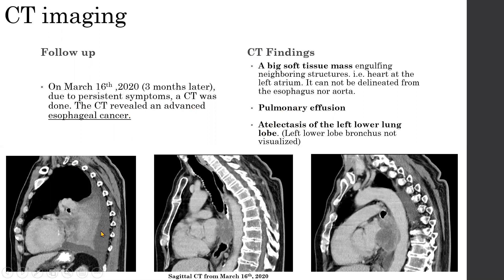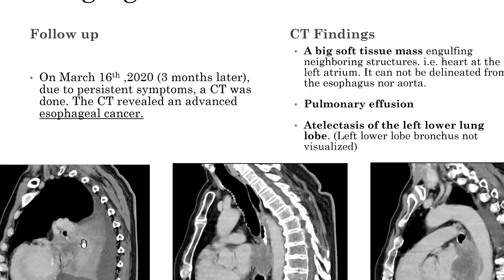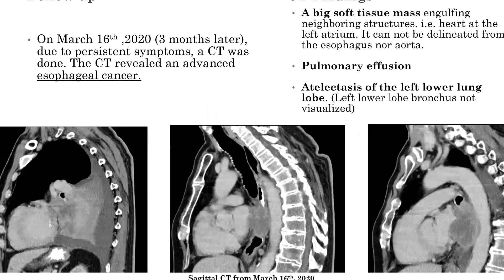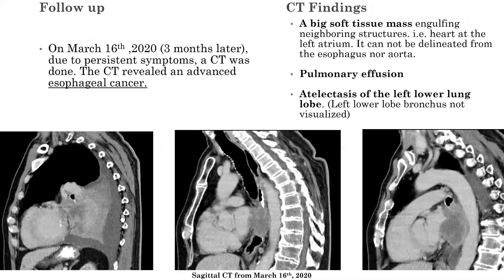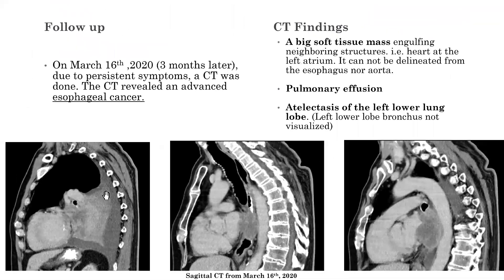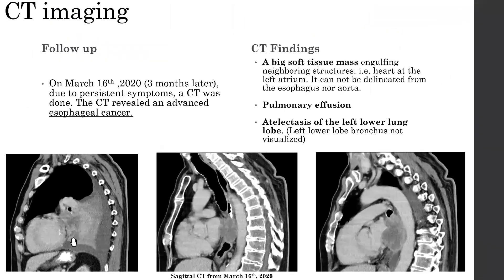On the CT images, the darkened density represents pleural effusion. A demarcating line is visible which separates the left lower lung lobe atelectasis from the soft tissue mass itself.